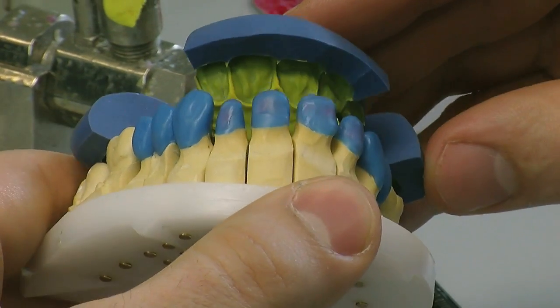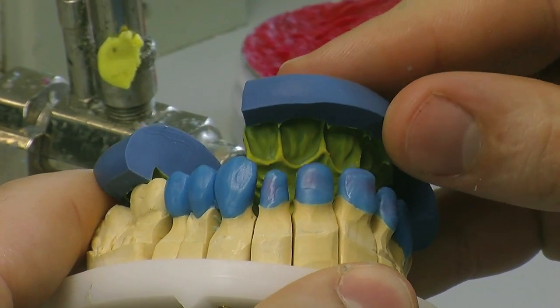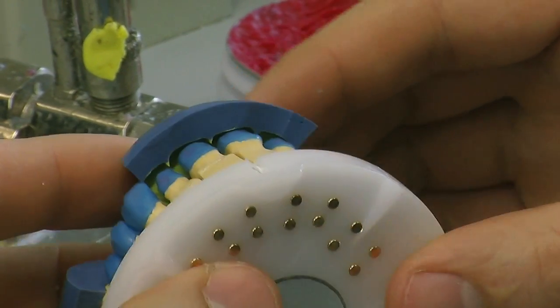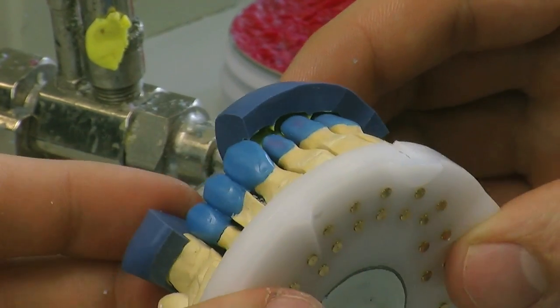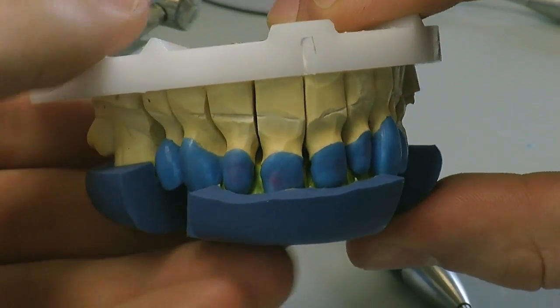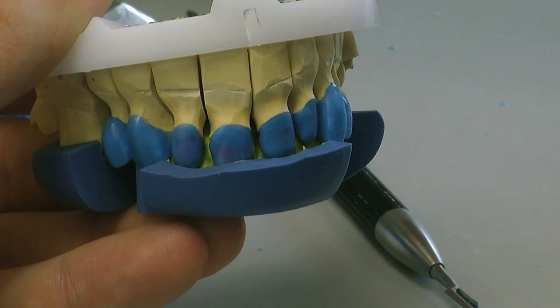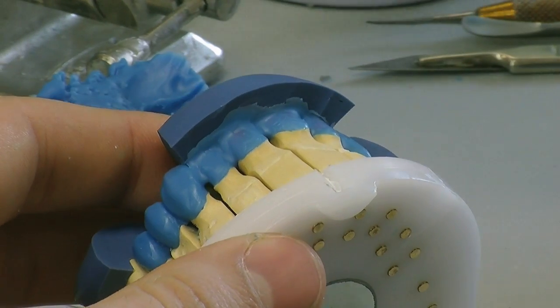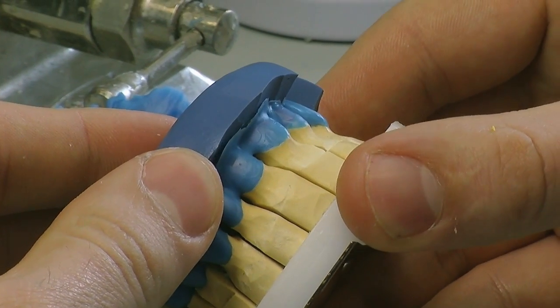What we're going to be doing now is using this putty to establish our incisal edge position. This is a rigid fast putty which we like to use in the lab because it's extremely accurate, and we've used a light body wash with this case. So we're going to put the wax inside the putty and connect the incisal edge to our substructure copings. We're just going to finish adding some wax to the front, and then reveal our incisal edge.